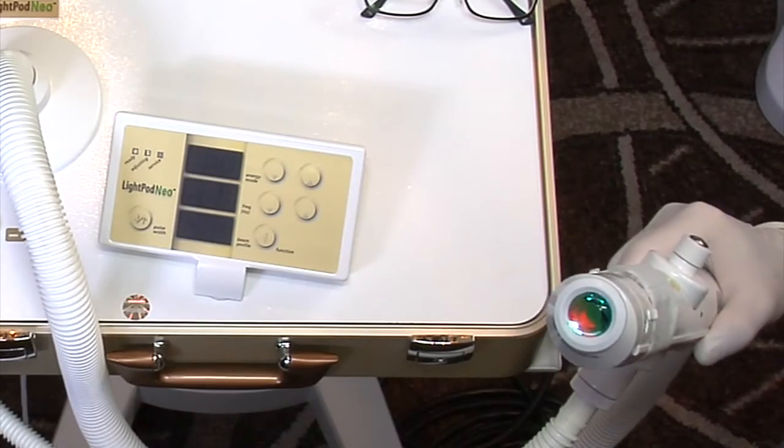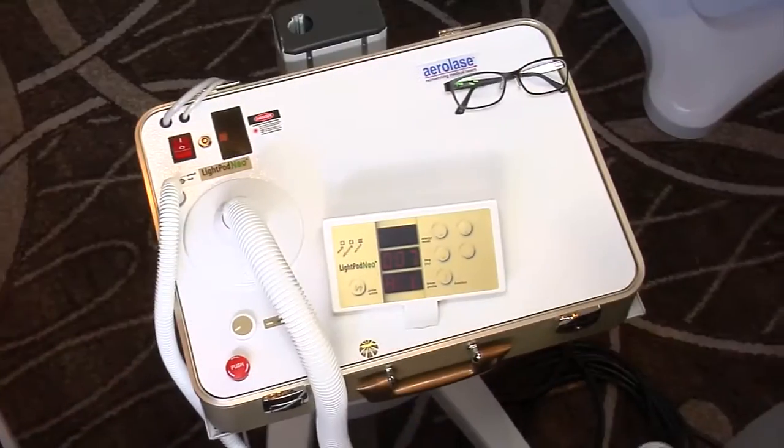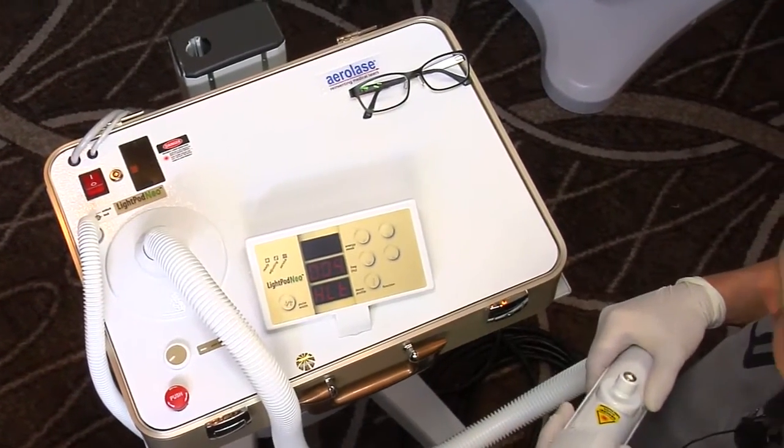This is a 6mm spot size — a pretty good spot size that I'm going to use. There are energy modes, which are levels, and I tend to use energy mode 3 to 4.